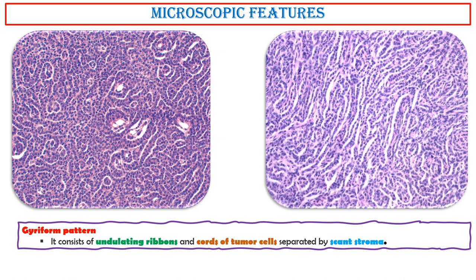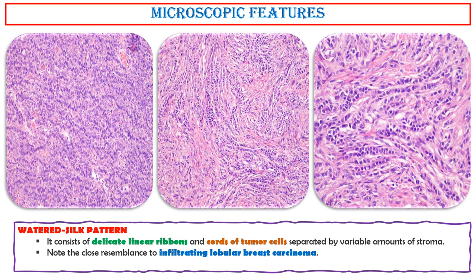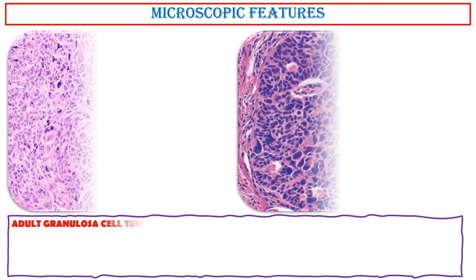Gyriform pattern. It consists of undulating ribbons and cords of tumor cells separated by scant stroma. Watered silk pattern. It consists of delicate linear ribbons and cords of tumor cells separated by variable amounts of stroma. Note the close resemblance to infiltrating lobular breast carcinoma; in cases like this, metastatic lobular breast carcinoma should be excluded.